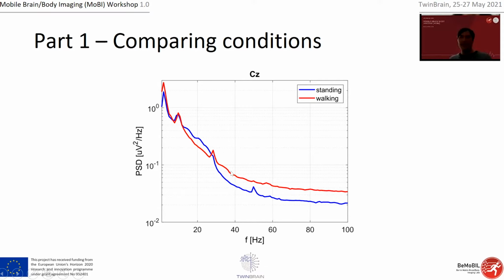And here I didn't do any sophisticated cleaning. That's why I think this is very stereotypical for muscle artifacts, and I'm going to talk about this in more detail later. But it's already quite nice because we know it's kind of the same thing, but there are some differences.